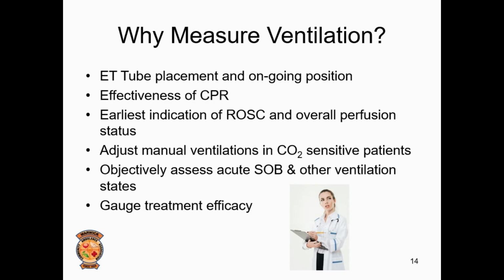We measure ventilation for several purposes. ET tube placement is one of them. The waveform of a capnogram can unequivocally confirm ET tube placement initially and throughout patient contact. End tidal CO2 can also tell us how well CPR is being performed and when the rescuer gets tired. Many times, ROSC will produce a spike in end tidal CO2, letting us know that we have ROSC, long before we'll feel pulses or before we're able to get a blood pressure.